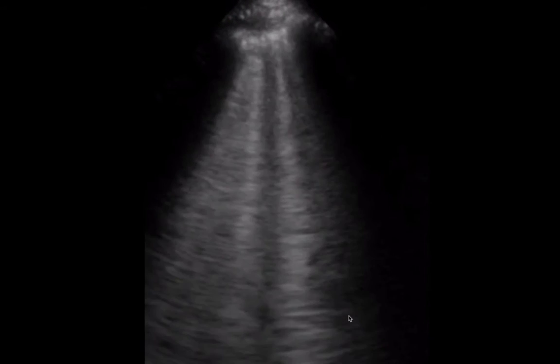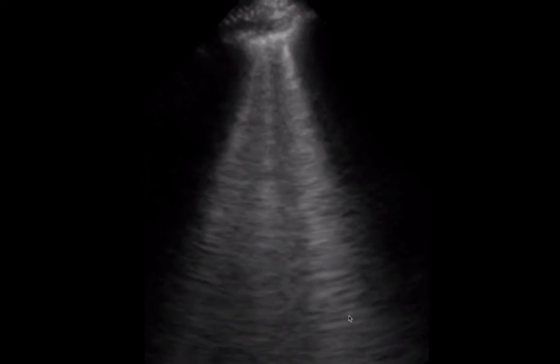Now, I know that for me personally, the A line keeps you up, the B line keeps me up. So I made myself a little graphic here to try and think about exactly how it's formed. So you imagine it this way.